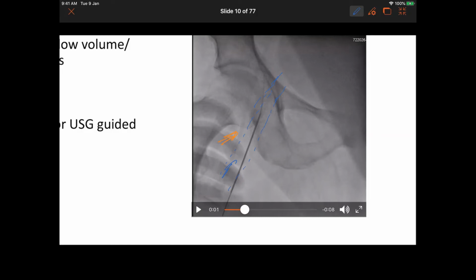So instead of a venous access, initial arterial puncture was done, and very sensibly a sheath was put in, because you should not be dogmatic about when you need an artery and vein. It's not an issue. If you get an artery, you put in a sheath.